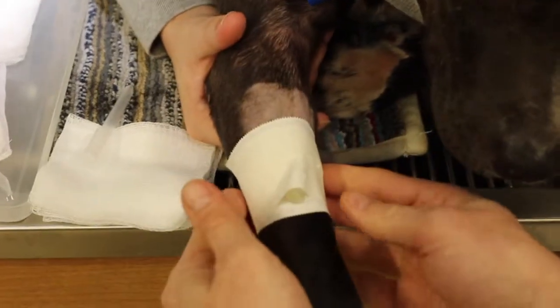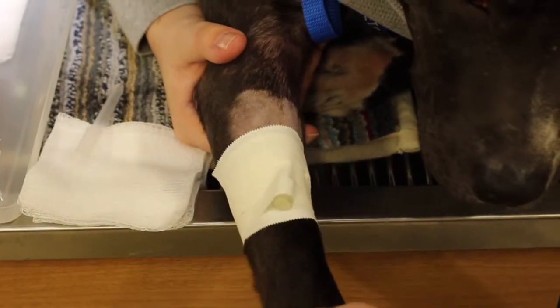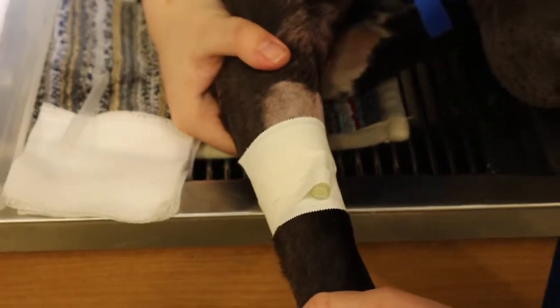Then we'll cover this in vet wrap, and I'll give it a little flush to prevent clotting. And she's getting ready for surgery.